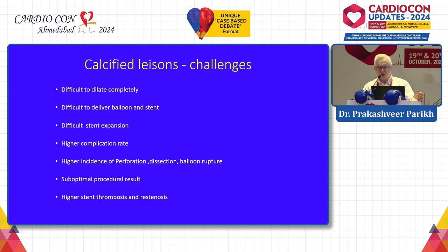This procedure is always complicated, associated with a higher complication rate, with higher incidence of perforation, dissection, and balloon rupture. And many times, whatever you do, you don't get the optimal procedural results. So we get bad acute and long-term results, with higher stent thrombosis and restenosis in the future.